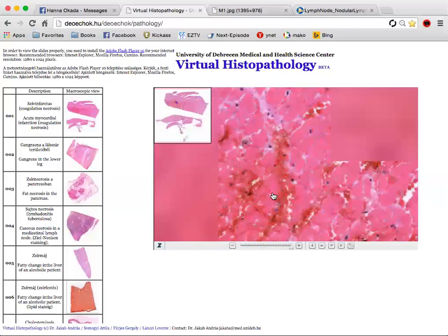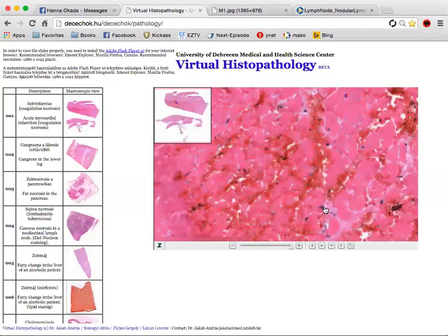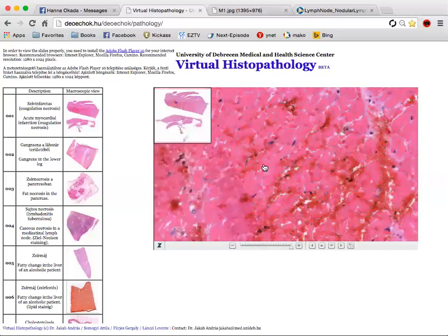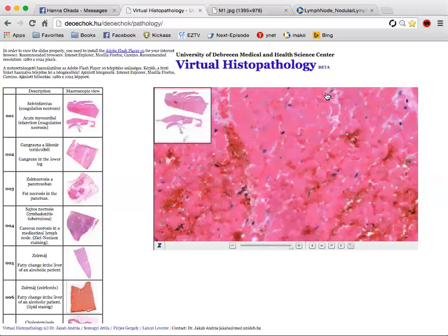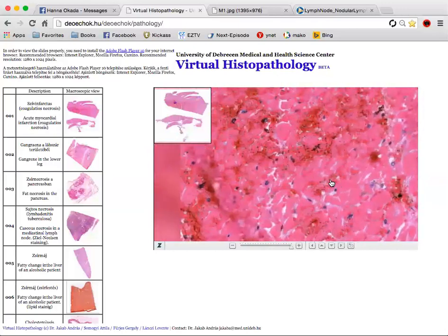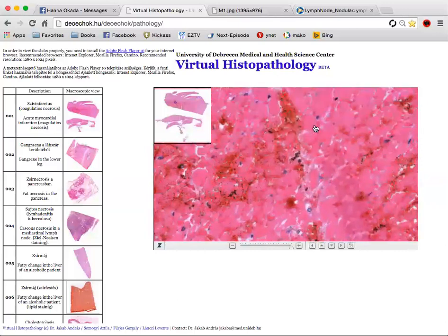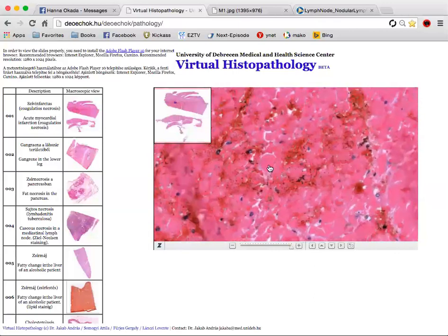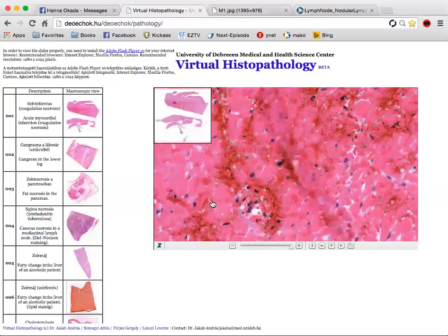And this is probably what you're going to get. This shows extravasation of blood, and the tissue is a lot more eosinophilic, with barely any nuclear staining. And if you see areas like this, this is partially digested blood, sort of like hemosiderin. All right, got it?